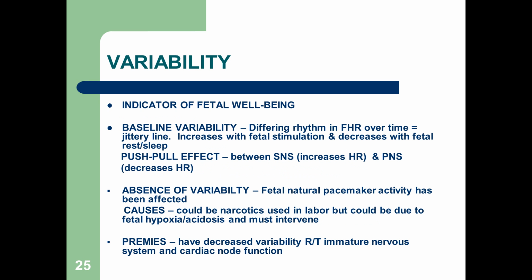Variability. Baseline variability is a reassuring fetal heart rate pattern, okay? So you want to see some variability. It's the differing rhythm in the fetal heart rate over time. It's like that jittery line. There's increases with fetal stimulation and decreases with fetal rest. It's like that push-pull effect. So you want to see some jittery lines, some up and downs, because that's the difference. There's a variation in the heart rate from the baseline. So baseline variability is a reassuring fetal heart rate pattern.